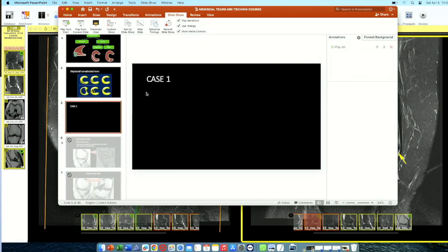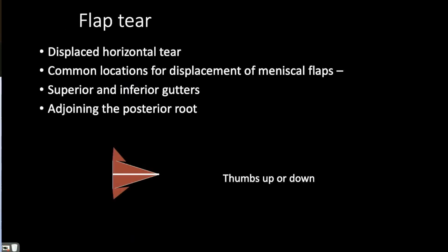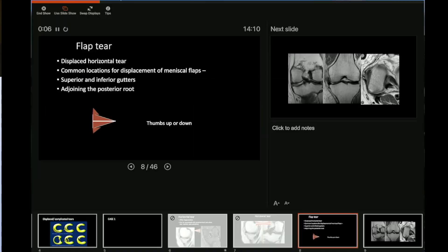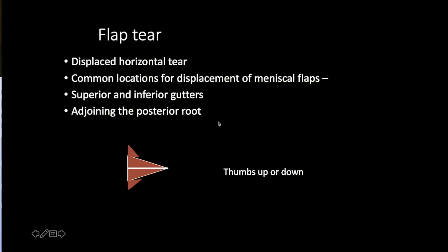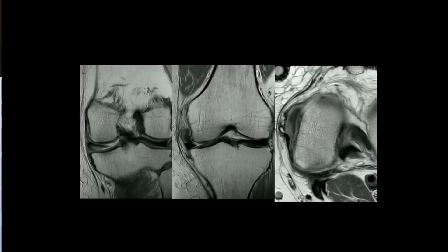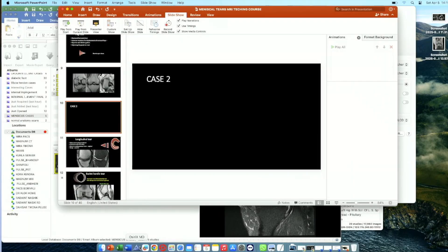A flap tear is a displaced horizontal tear. Common locations for meniscal flaps are the superior and inferior gutter, as well as adjoining the posterior root, and the anterior intercondylar notch. In another example, you can see that there is a horizontal tear, the inferior part of the meniscus is missing, and coming anteriorly this is a thumbs up sign where the flap is displaced in the superior medial gutter.